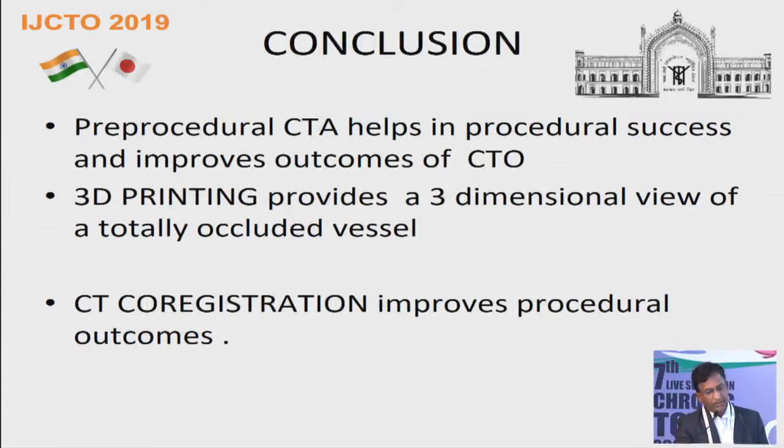To conclude, pre-procedural CTA helps in procedural success and improves outcomes of CTO. 3D printing provides a three-dimensional perspective of the totally occluded vessel, and CT co-registration improves procedural outcomes. Thank you very much.